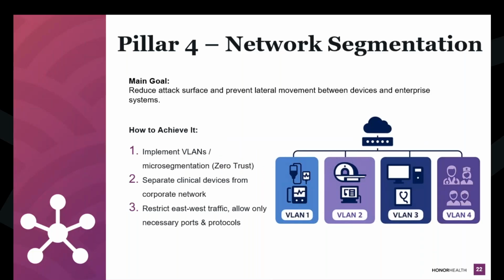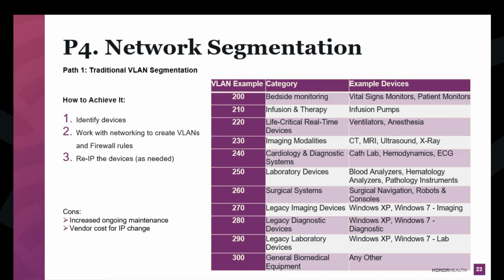North-south is outside of your organization to your device, okay? And only allow what's necessary for communication. You don't want to have it wide open. We're going to restrict it to just the necessary ports and protocols.